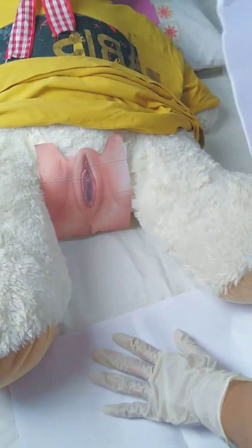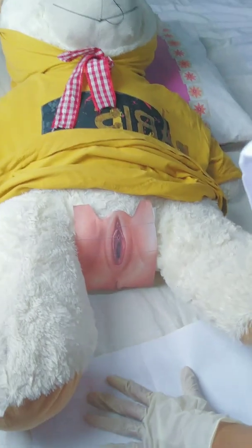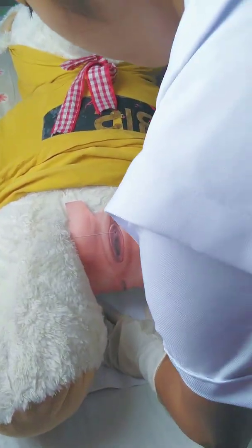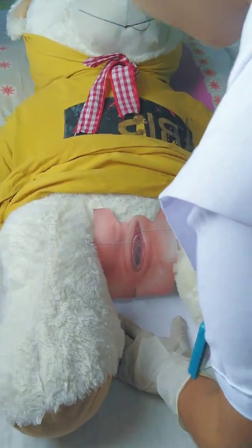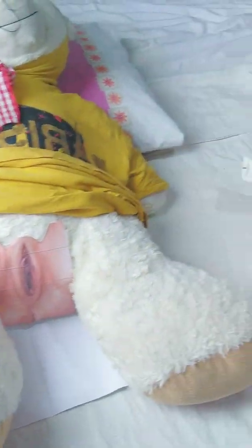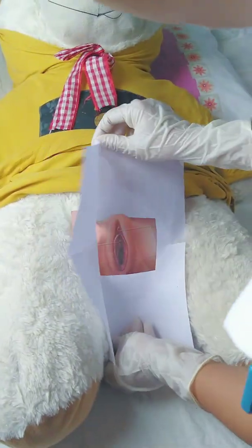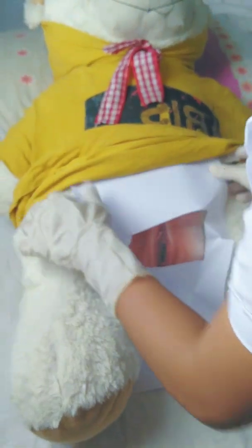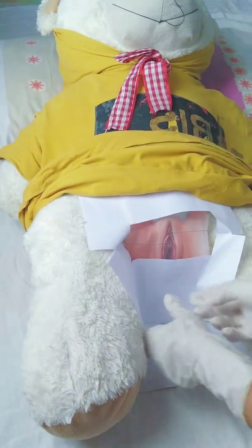And then ask the patient to slowly raise her hips. So, Mom, can you slowly raise your hips, Mom? And the next is to put the fenestrated drape over the labia. This drape is for the patient's privacy.